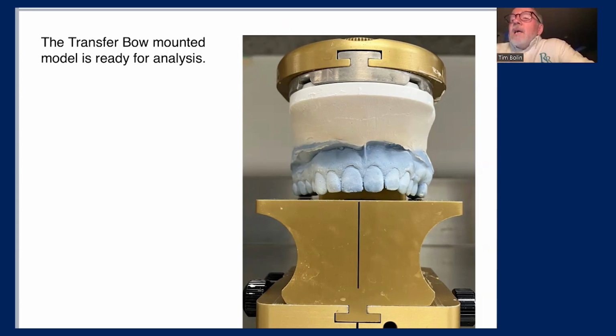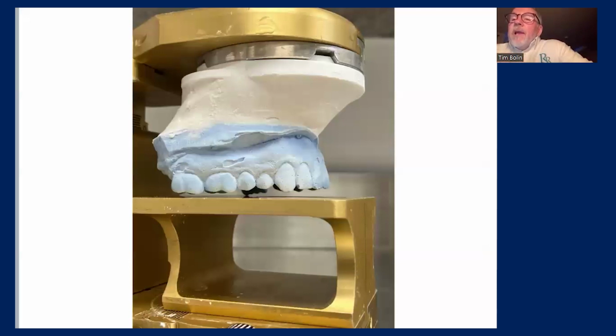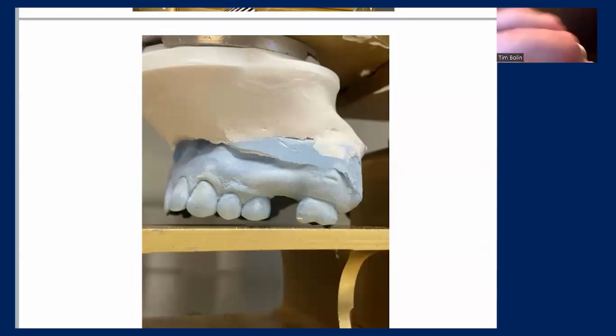Now you can see it pitched up in the anterior, making contact on that left molar. So where do you go with this case? At least you've got a good idea. You've got a reference plane to view these cases from. I think that's exceedingly important in all the casework that we do. On the patient's left side, you see the first point of contact on that molar. Everything else is open.